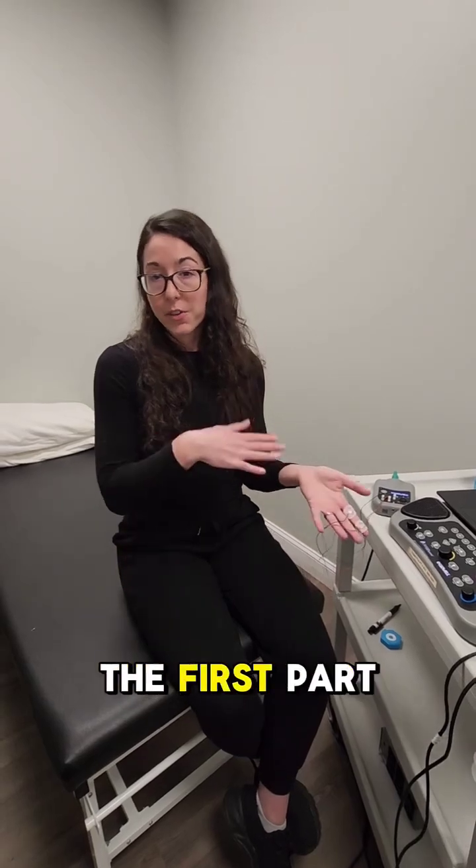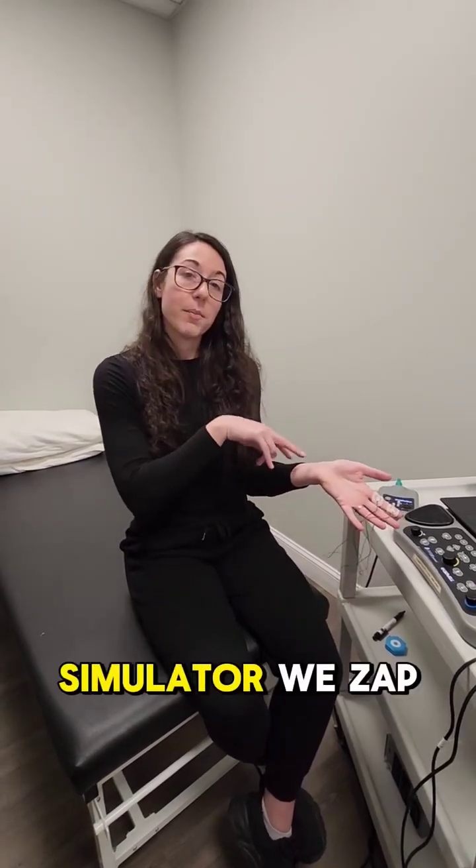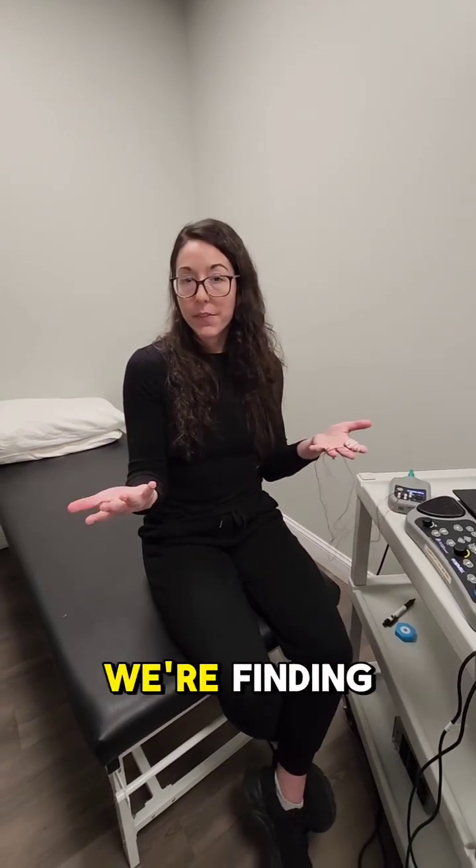There are two parts to the test. The first part is we do the little stimulator — we zap a little bit of your nerves depending on what we're finding.